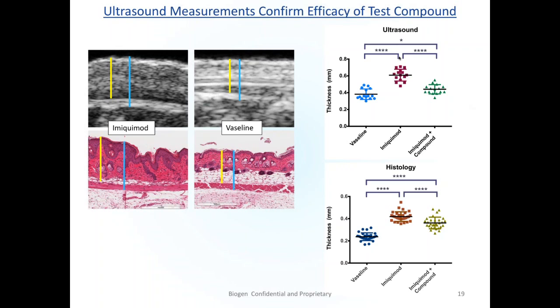So I think that kind of explains it. You're measuring in the order of hundreds of microns, certainly less than a millimeter, so using the higher frequencies to get the resolution is almost necessary at that stage. Yeah, I think it really made a difference to sharpen up our images and to be able to get this kind of definition.